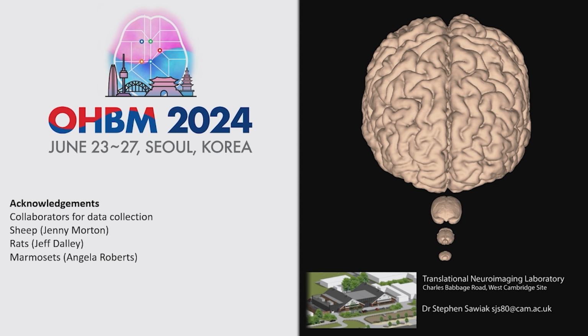So regarding diffusion, but instead of using diffusion as a way to study diffusion per se, I've been surprised how much anatomy detail I can get with just diffusion. And you can get by with the tricks you showed at the end, like TopUp, or you can use diffusion encoding in a simple spin echo or something like that. So my question is, have you investigated the utility and efficiency of diffusion versus, say, MT or T2 or T1 for anatomical imaging?